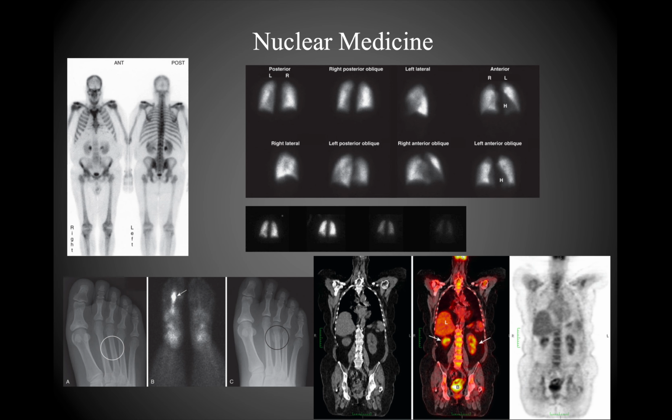If you look at the images captured in nuclear medicine, they often look somewhat similar to X-ray since they're 2D images of 3D structures. But we've been able to make some advances in this field recently where we can do overlays with CT scans and these sorts of nuclear medicine-based imaging modalities.